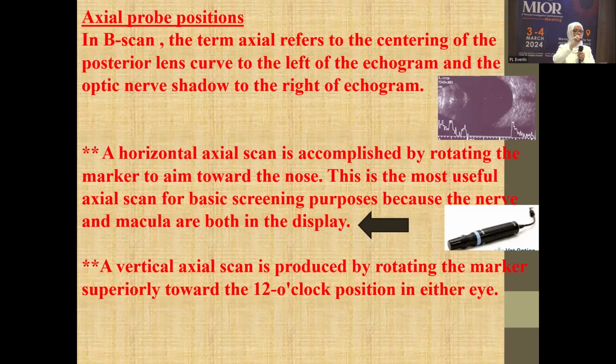So when your arrow is nasal, the upper half of the screen will be nasal. So the temporal part will be down.